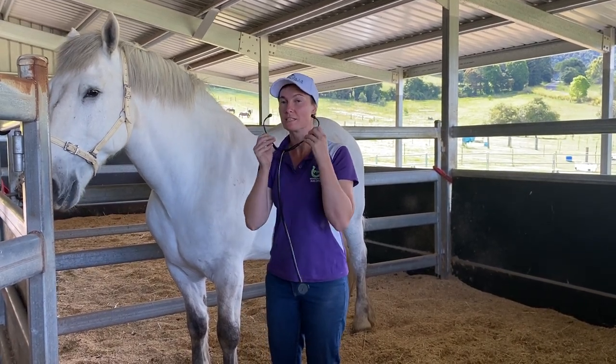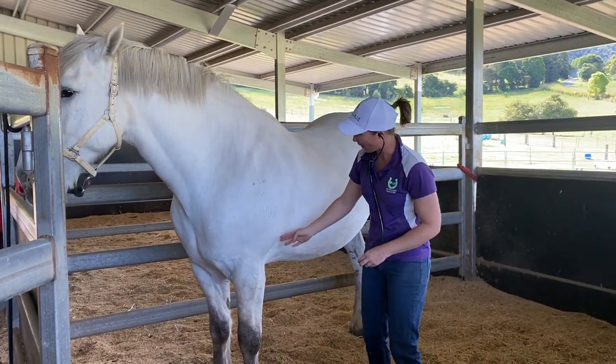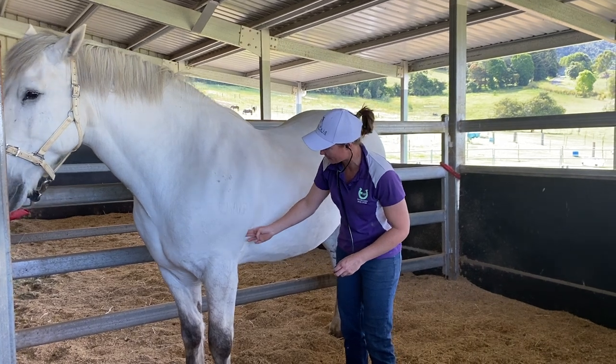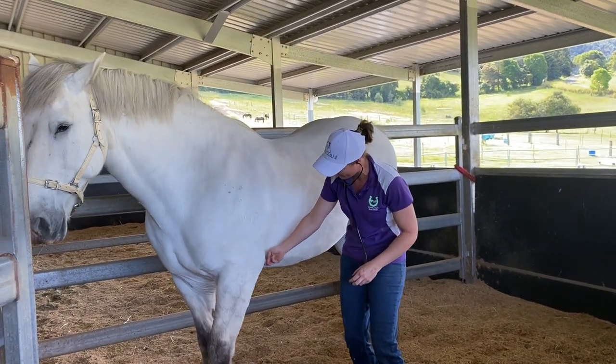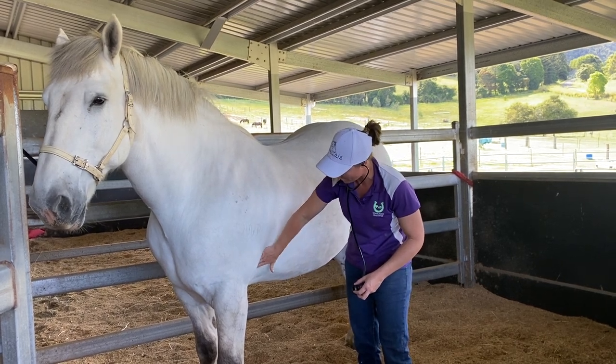Place your earpieces within your ears like so. When you want to listen to your horse's heart, you need to find your horse's elbow. You can see on this gelding he's a little fat, but he's just going to show us just here. And put your stethoscope against the thoracic wall, so the wall of his chest.